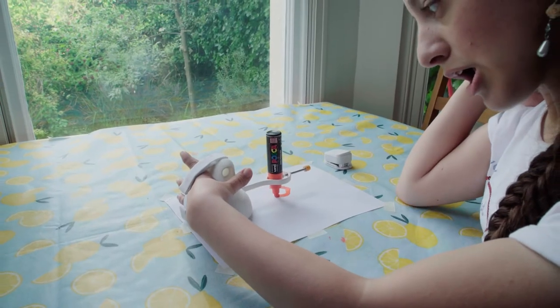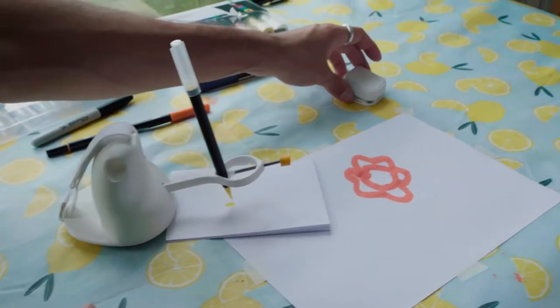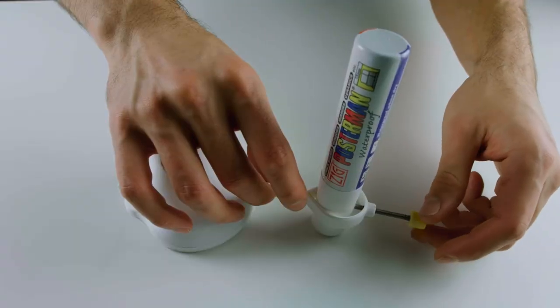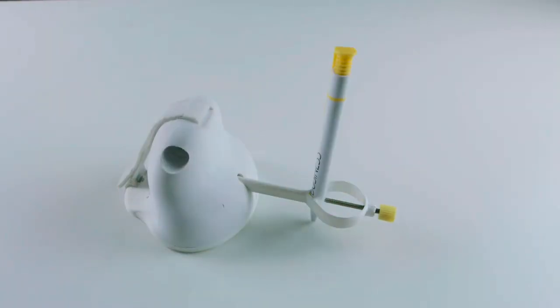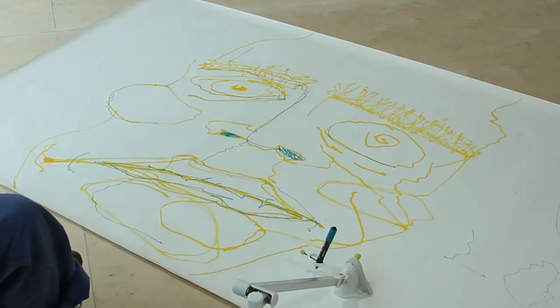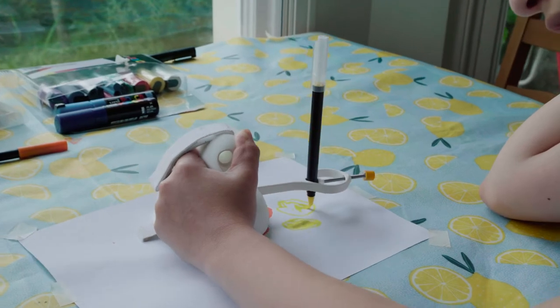ENABLE is a drawing tool that allows anyone with a physical disability, including the most highly paralysed people, to independently draw. It takes traditional art equipment like pens and chalk and makes them accessible. It can be used by people in wheelchairs drawing at floor level, and by people with dexterity disabilities as a supportive hand tool.